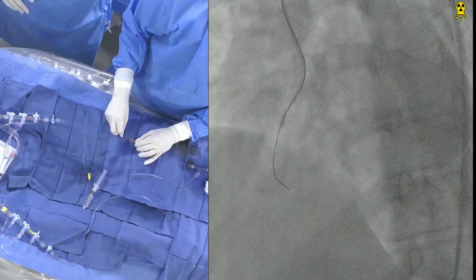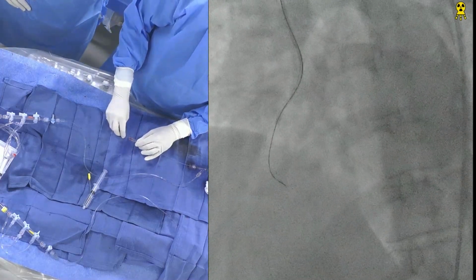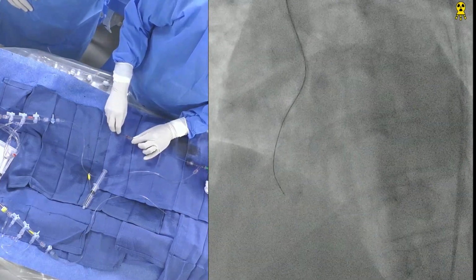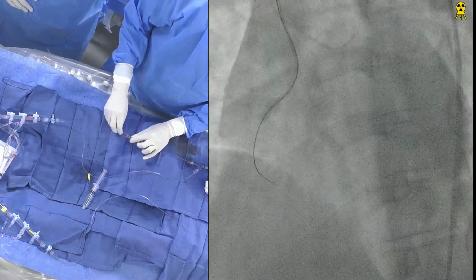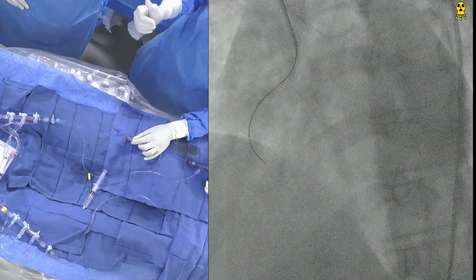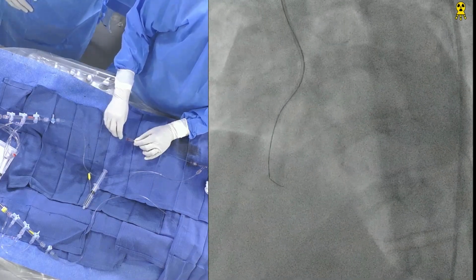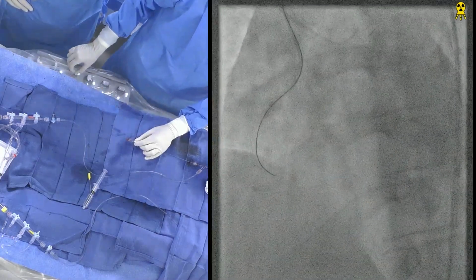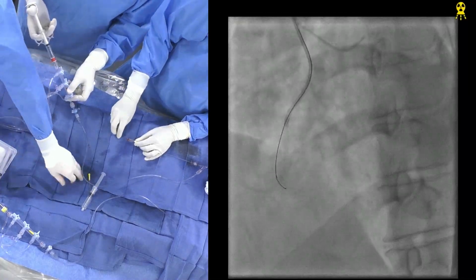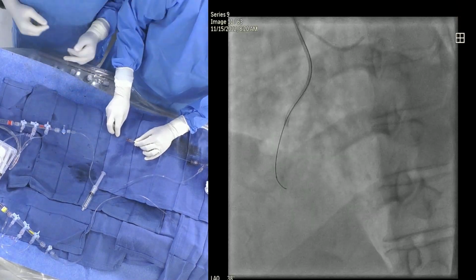What about the anticoagulant strategy? We have Angiomax with the ACT about 285. At some sites, a lot of people will be worried about giving Angiomax in terms of not being able to reverse it. I can tell you, we actually published our paper on wire perforation. They did better with bivalirudin versus heparin, because with heparin you have to reverse it, and all those issues taken together. So we actually routinely use bivalirudin, but yes, people who are concerned want to go with heparin, and that's okay too.